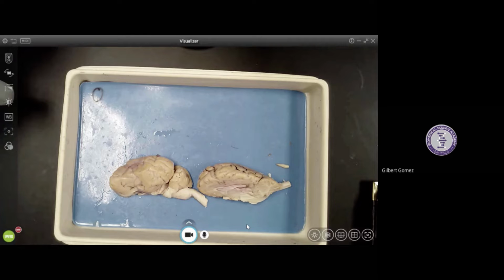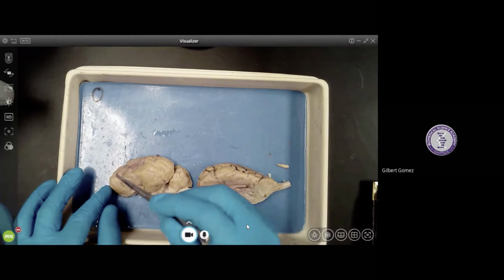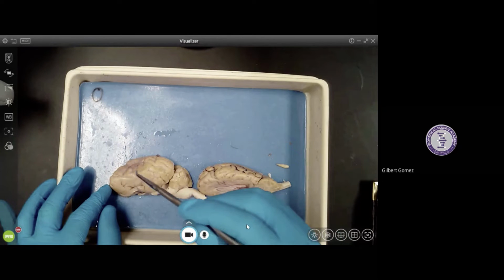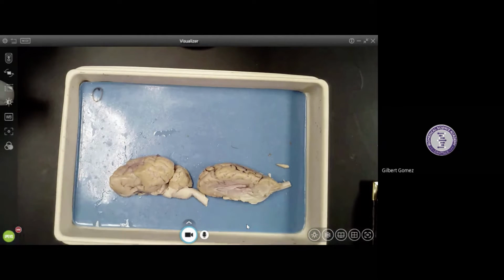And if you want, you don't necessarily have to, but in that document I gave you up on top, if you want to just write those in, you can write them in. Be another cool study guide for you guys. All right. Parietal lobe. Parietal lobe is going to be more here up on top. Okay, kind of up on top of that temporal. Okay, but this is going to be your parietal lobe in here.